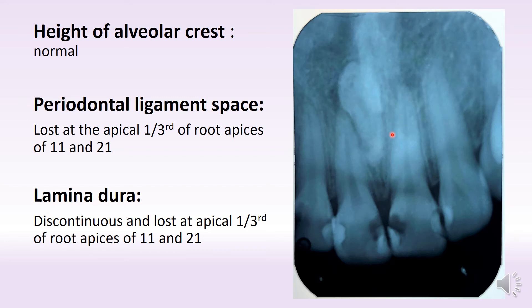Similarly, even in 2-1 you can follow the white line of lamina dura all the way up to the apex or even on the distal surface. But somewhere at the apex it gets blurry and you can't see the lamina dura and PDL anymore. So we have interpreted this as loss of PDL and discontinuous lamina dura at the apex of both 1-1 and 2-1.